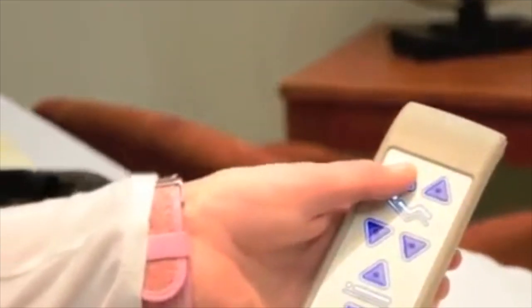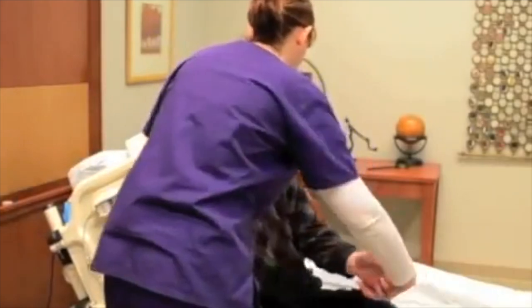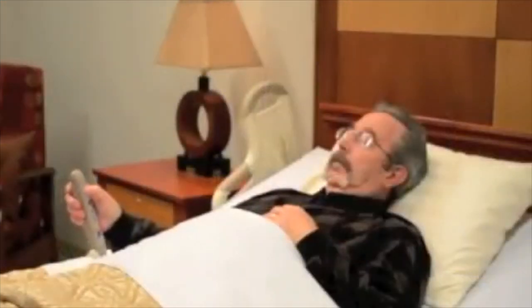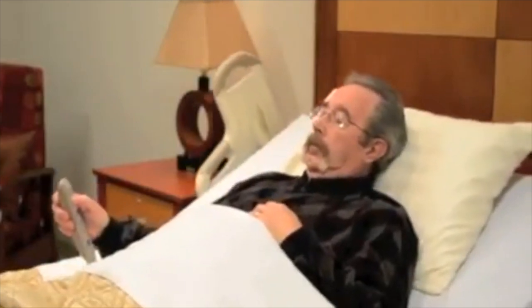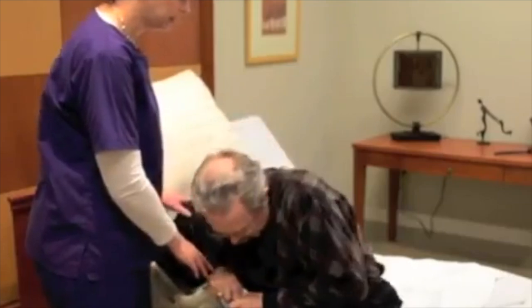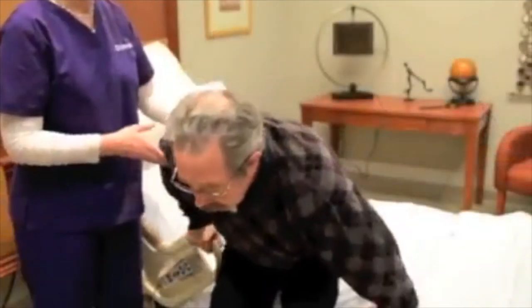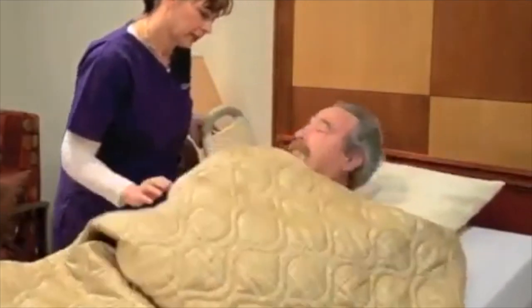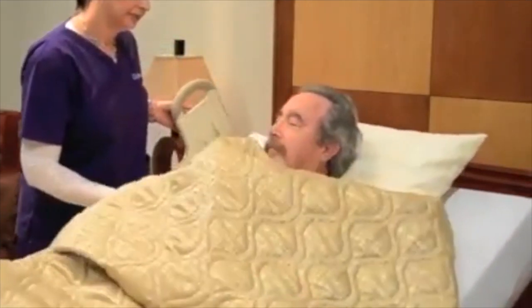An important benefit of placing the bed in this position is that it reduces the amount of strain that is often placed on the caregiver's back when they are helping residents in and out of bed. Adjusting the bed in this way puts the resident in a better position so that they can get out of bed with less assistance from the caregiver.